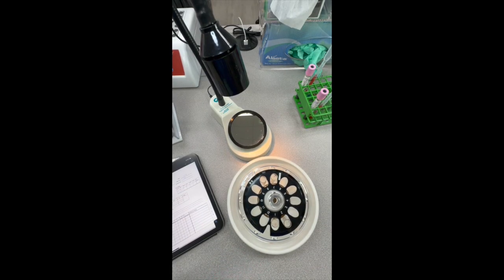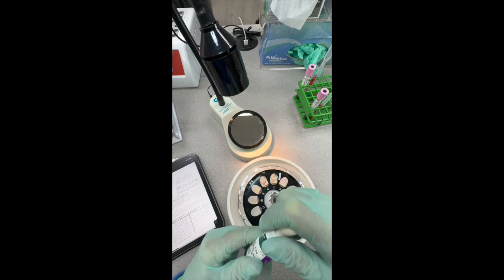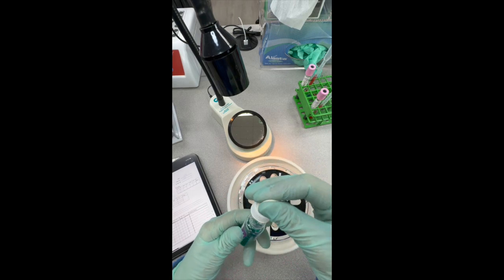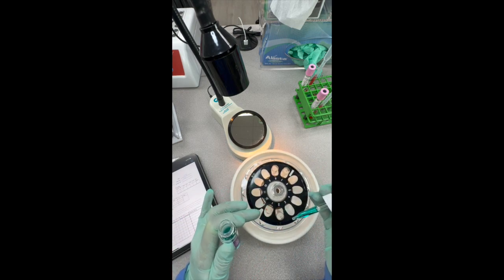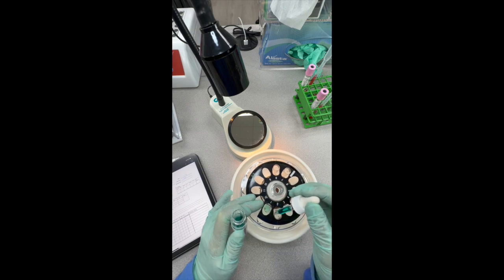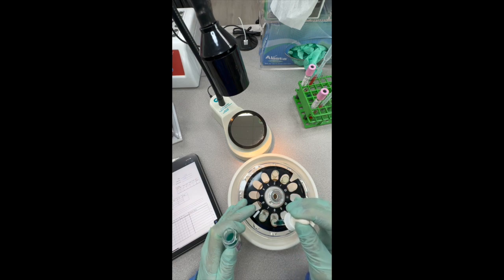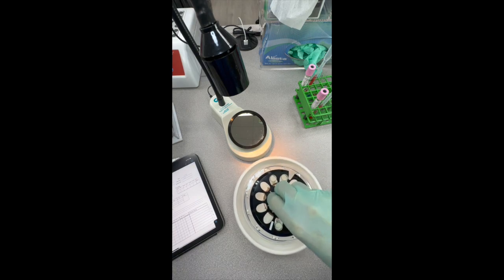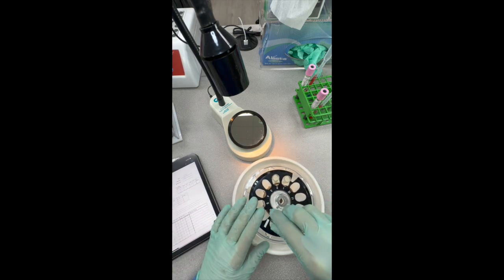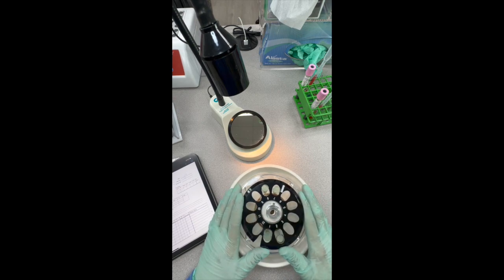Okay, we're back with our cells from the cell washer. We're going to add our AHG, our anti-IgG and C3d, or our Coombs, our anti-human globulin. It has a couple different words. We have to get used to hearing those. So 2 drops here, 2 drops here, around here 2 drops, and 2 more drops. Give it a shake, make sure they're mixed really well, so you can see our reactions. Okay. Off to the centrifuge, and we'll be right back.